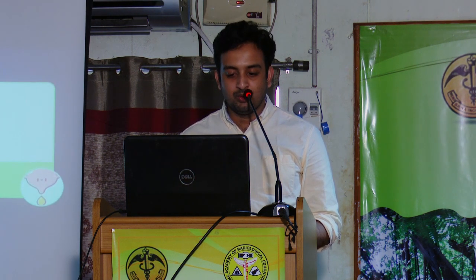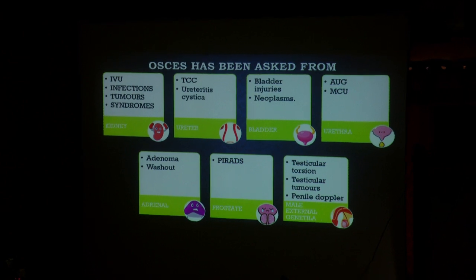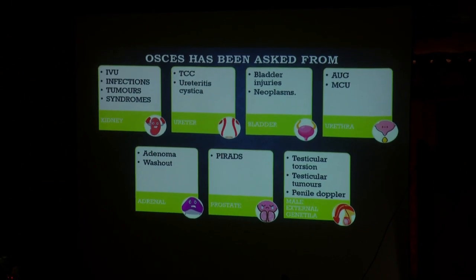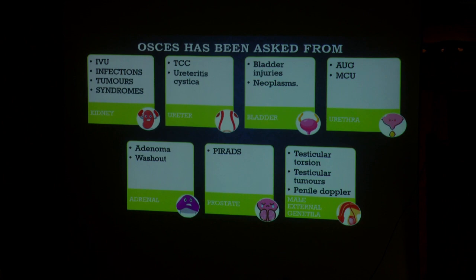As you all know, so many questions have been asked from the genitourinary tract. This is a vast system including kidneys, ureters, bladder, urethra, adrenal gland, prostate, as well as male external genitalia. So I will try to cover as many questions as possible in this short time.